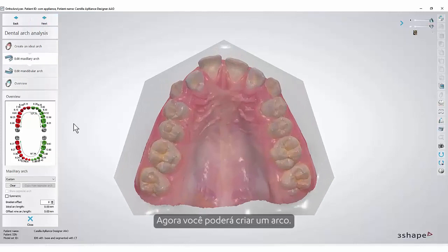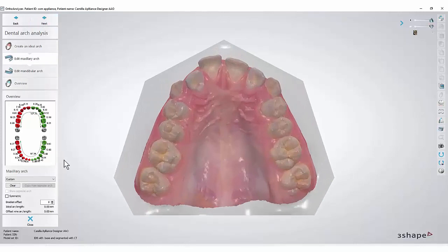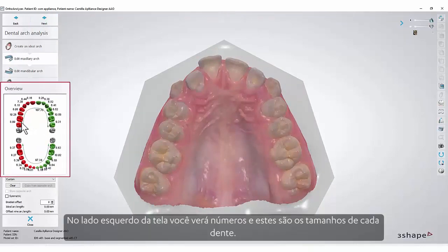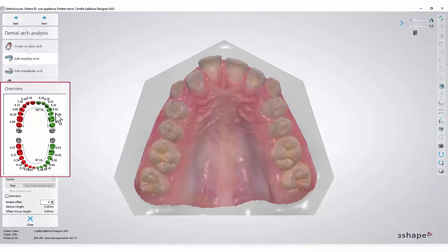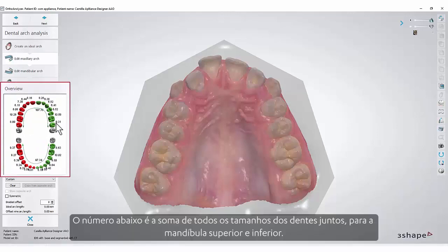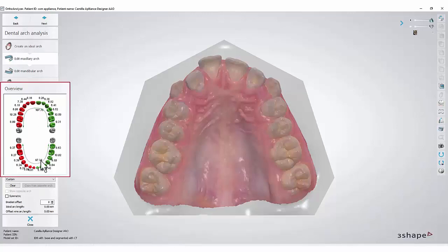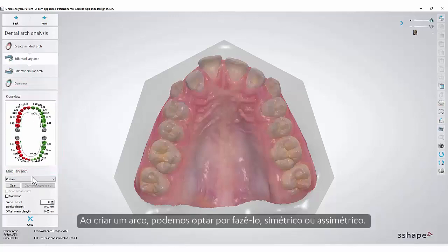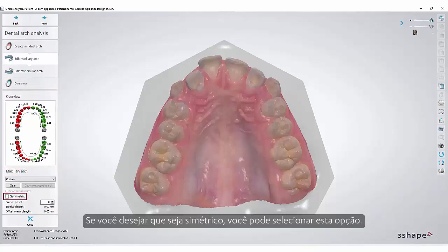Now you will be able to create an arch. On the left side of the screen you will see numbers, and these are the sizes of each tooth. The number below is the sum of all the teeth sizes added together for the upper and for the lower jaw. When creating an arch we can choose to make it symmetric or not symmetric. If you wish it to be symmetric you can select this option.